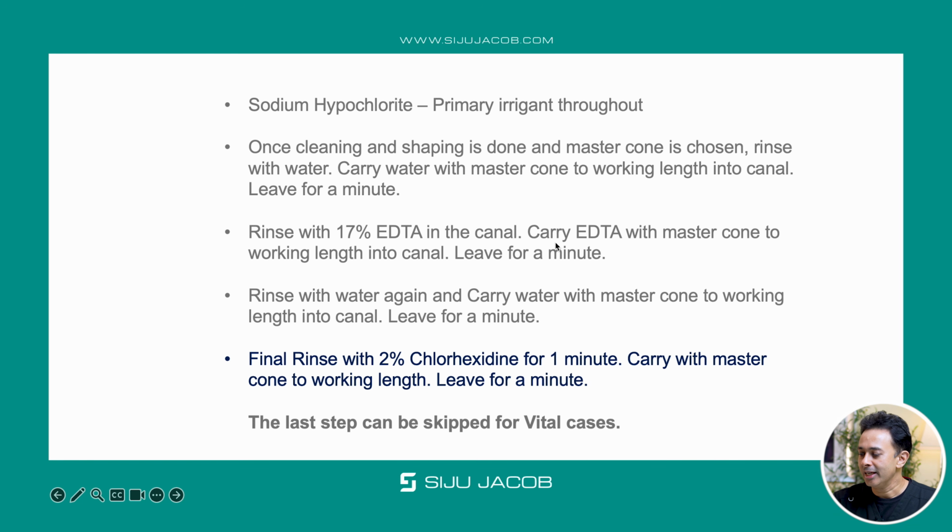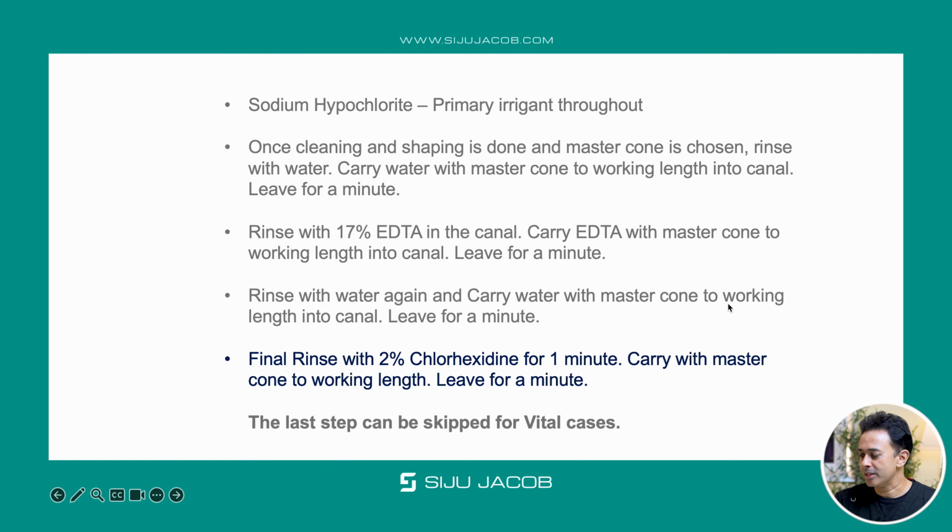And then we rinse with 17% EDTA in the canal, carry EDTA with master cone to working length into the canal, and then leave it for a minute. So you want to leave the EDTA in the canal for approximately a minute so that you get enough time to remove the inorganic components of the smear layer. Once that is done, you want to neutralize the EDTA that's in the canal. So again, you rinse with water and you carry the water with master cone to working length into the canal, rinse copiously with water, and then leave it for a minute.